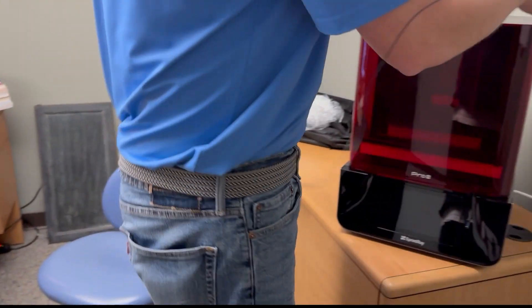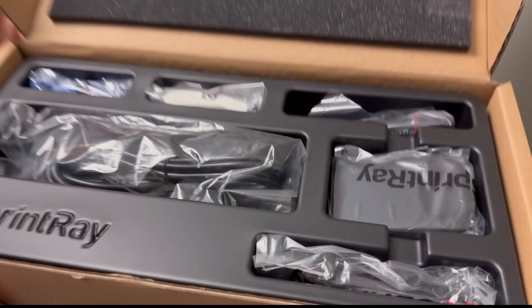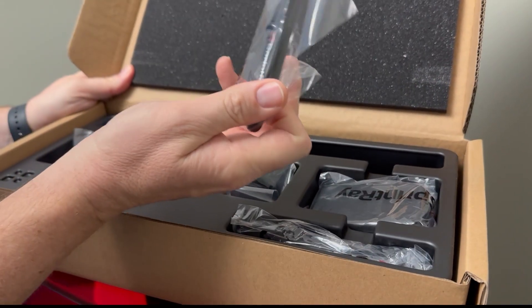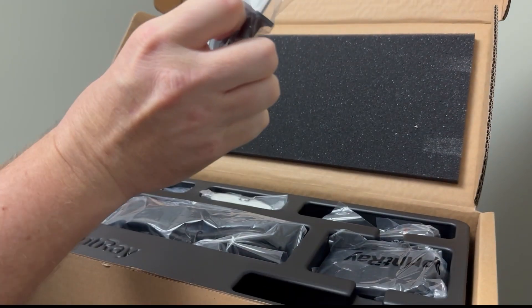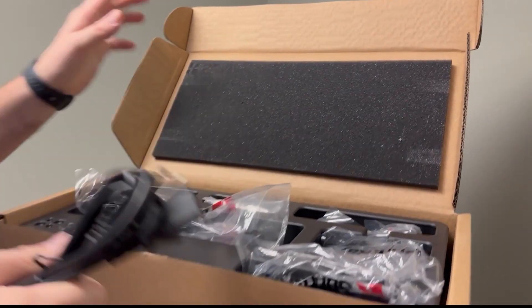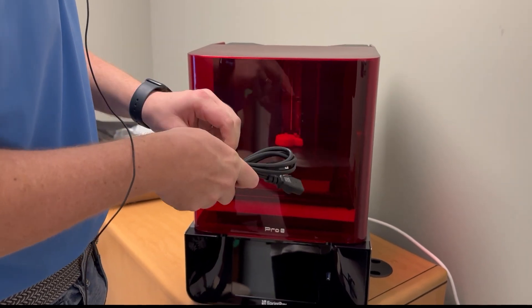There's the power cord. Let's open the accessory box — you've got some cleaning cloths, a little tool to cut scaffolding with, something to mix the resin, a tool to pop models off the build plate, and the power cord. Let's get that power cord. You guys can see you need a little bit of a work area to get this thing unboxed and working.